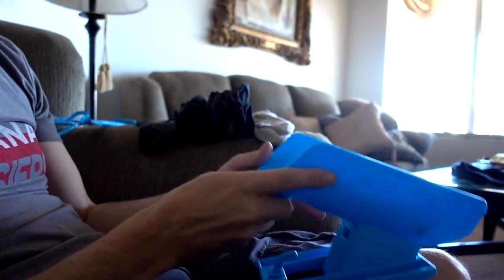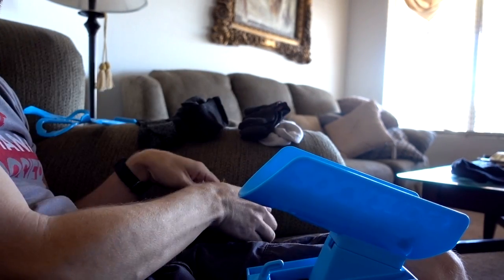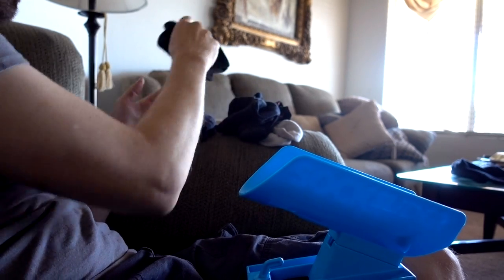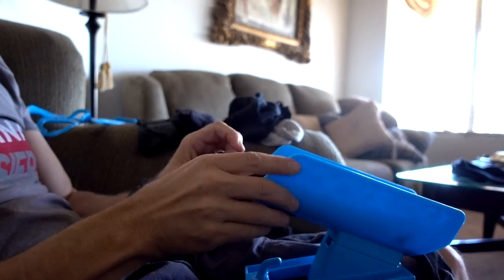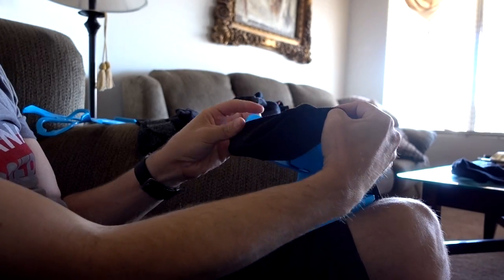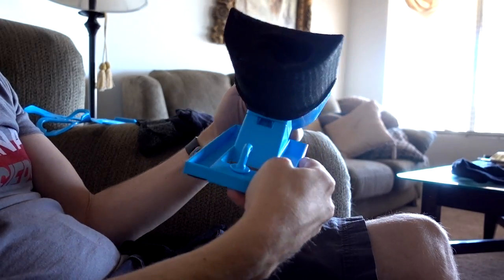First, you're supposed to put the Sock Slider up on your lap and put the socks over it. I've got a bunch of different socks — tighter ones, looser ones, shorter ones, longer ones. I'm going to start with a regular pair of Reebok socks. What you're supposed to do is place the sock over the opening like this and kind of push it downward.